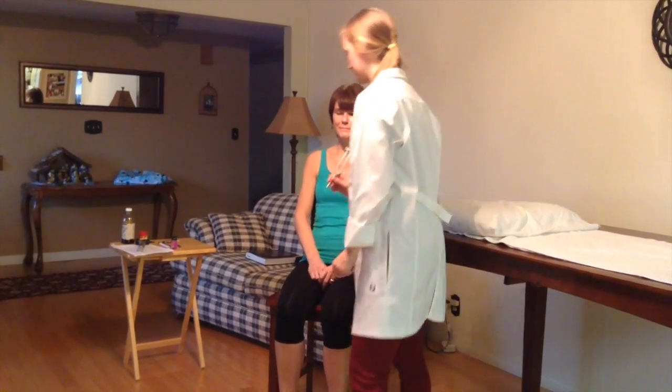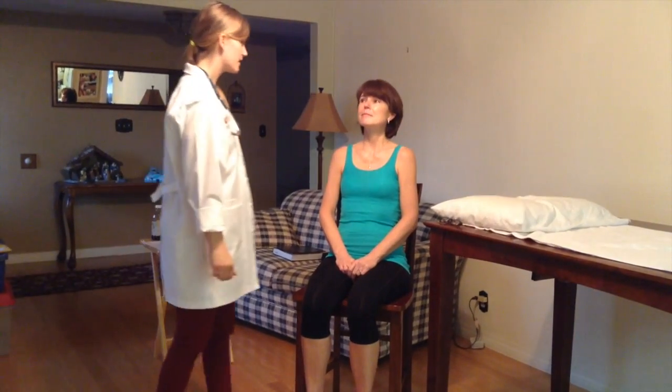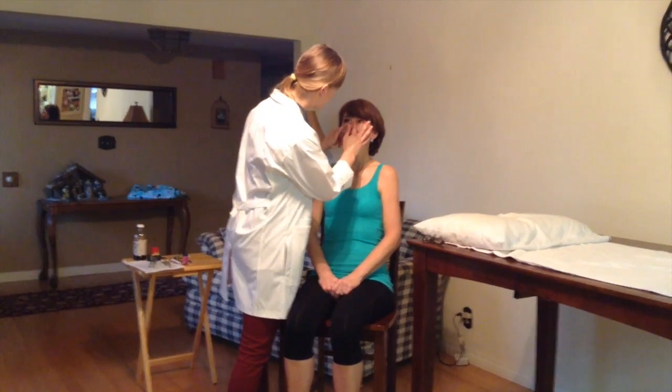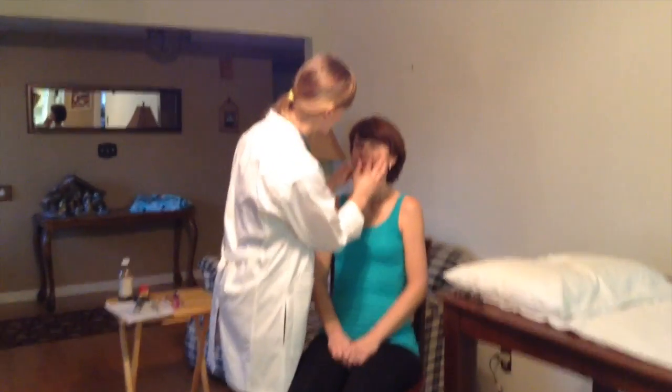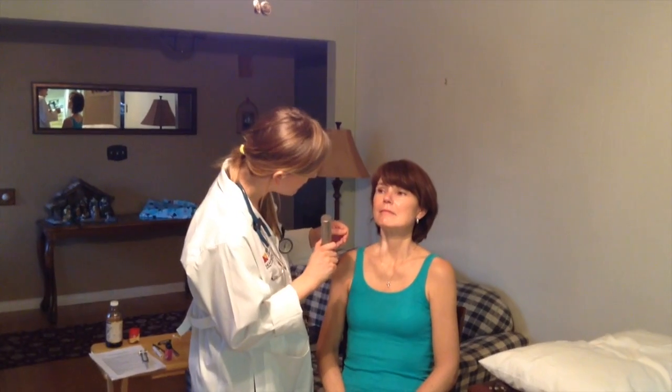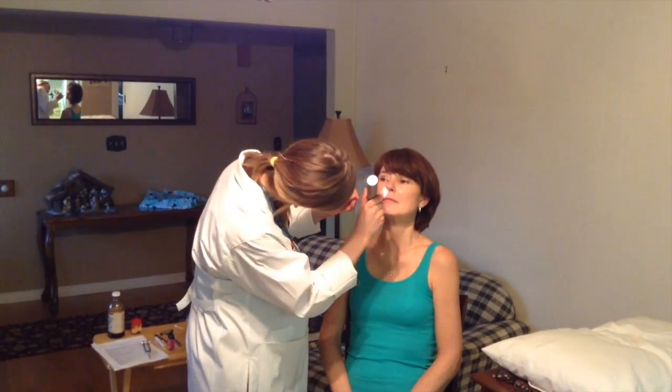Okay. Great. And then move on to your nose. Just going to start by looking at your septum for symmetry. I'm going to palpate here. Any tenderness when I do that? No. Okay. So I'm going to pull out my scope again. I'm just going to take a look in it, okay? I'm just going to be really gentle and look up in it at the mucosa and the nasal passage.